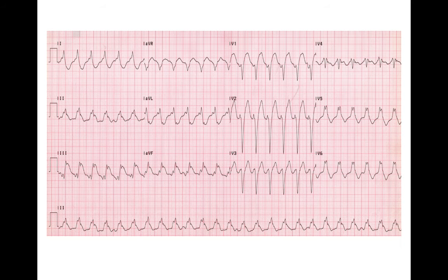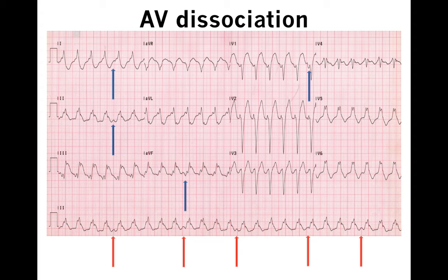This is an example of a wide complex tachycardia. In order to figure out if this is VT or SVT with aberrancy, we look for the features discussed. If you look closely, you see P waves within the tachycardia, but there are more QRS complexes than P waves. If there are more QRS complexes than P waves, this must be ventricular tachycardia.